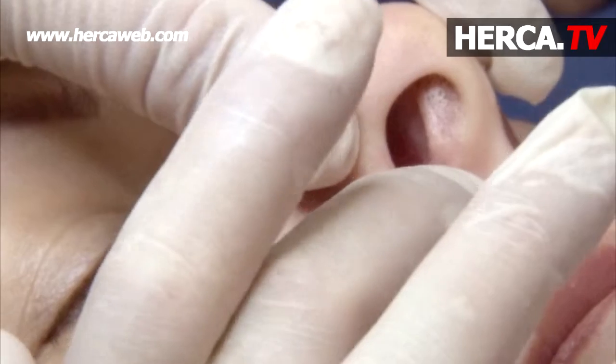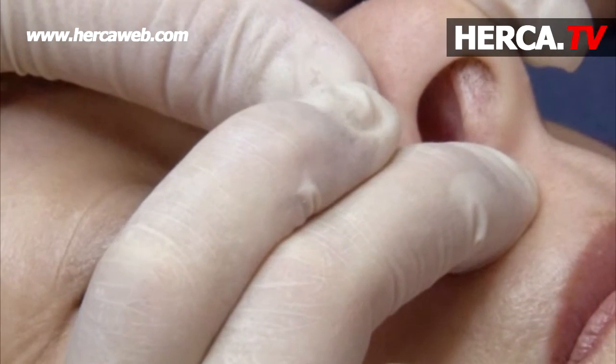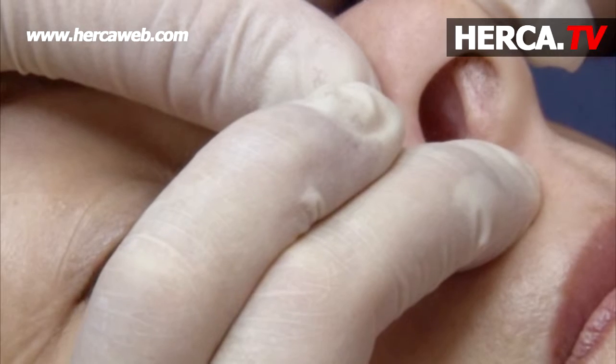I need to make a good pressure again. Five seconds: one, two, three, four, five. All right.